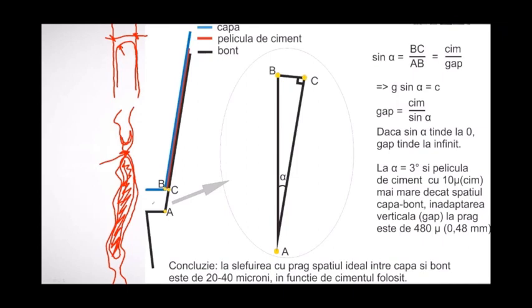So most of the time we do use shoulder preparations, not knife edge preparations. And then you have two problems if you don't have the space for the cement. First, the crown is high, and then you have the gap between A and B, in between the crown and the tooth. There you will have a little bit of cement for the first part of the time, but then the cement goes away, is washed by the saliva, and there you'll have food retention, and eventually your abutment will be destroyed.